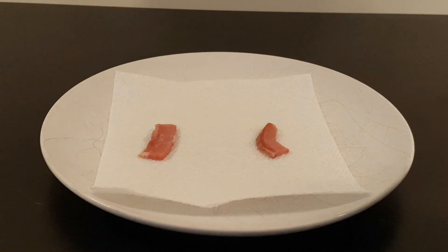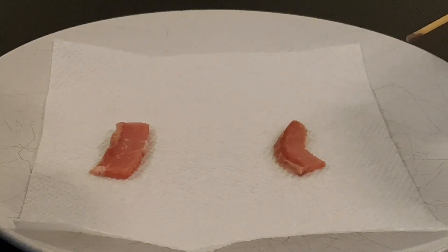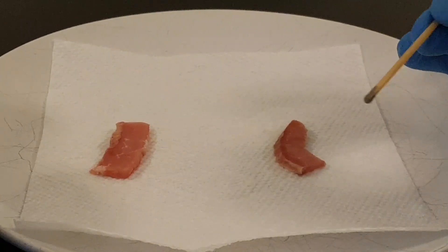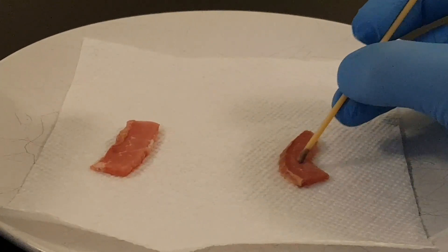The first method is to go straight at the wound or the tissue that you want to use silver nitrate with. The moisture in the wound will activate the silver nitrate tip and you should start to see some action shortly into starting it.